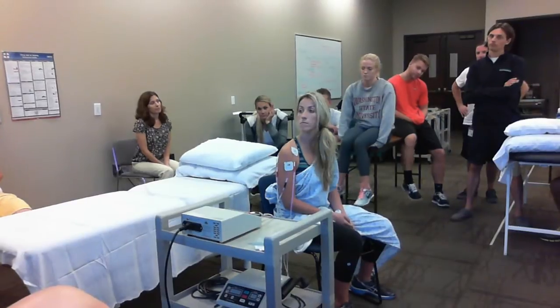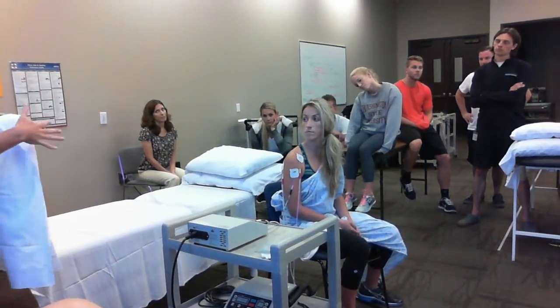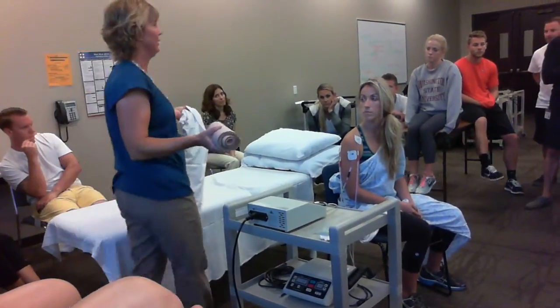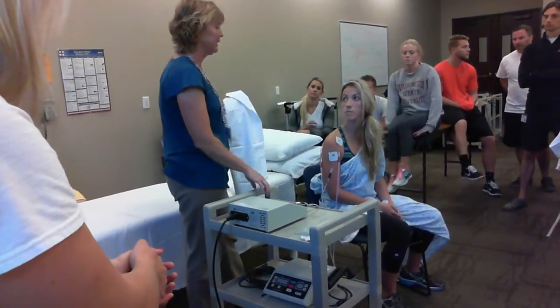If this is her very first time, I might want to see how she responds to this and then wrap her up with the cold. But that's completely up to you guys. The important thing is that you're emphasizing to your patient a tingling only, no pulsing sensation.